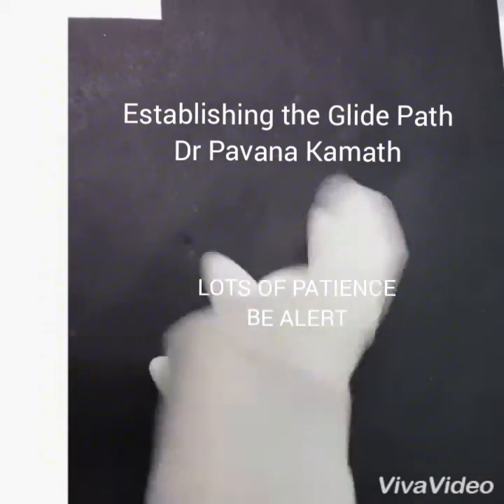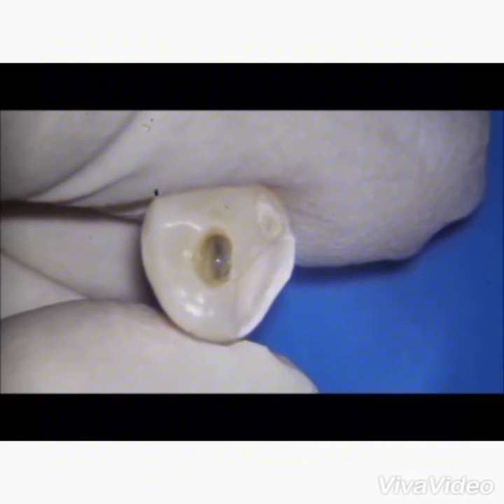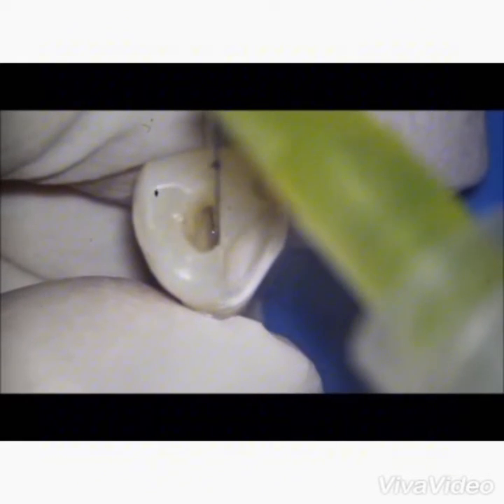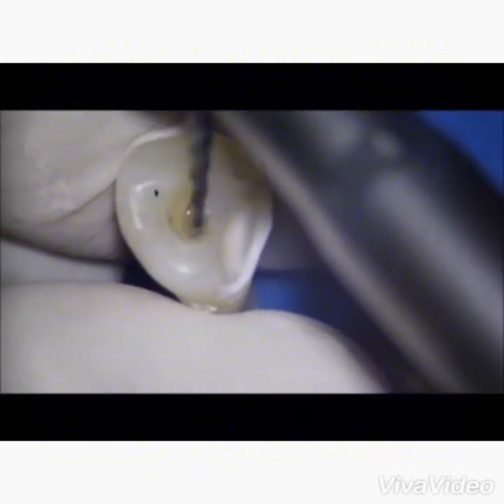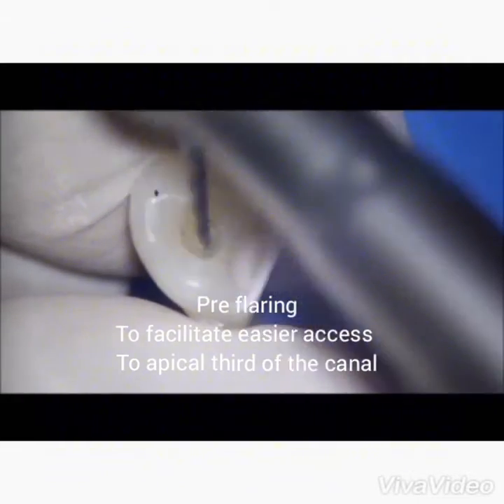A well-fitted glove is essential for optimal tactile sense during glide path. Once the access is established, flood the chamber with the preferred irrigant, sodium hypochlorite. Now locate the coronal orifice and pre-flare the coronal third to provide easy access to the apical third.